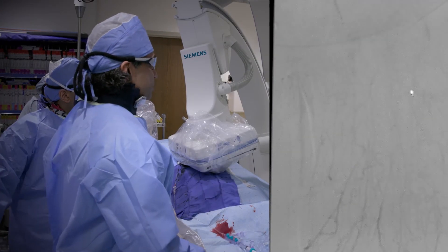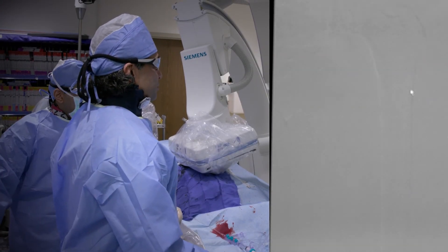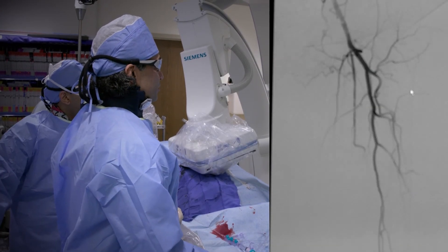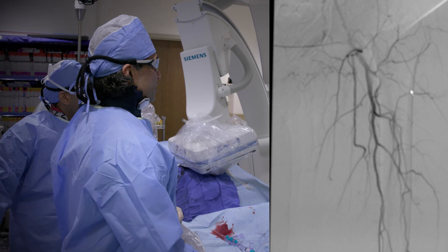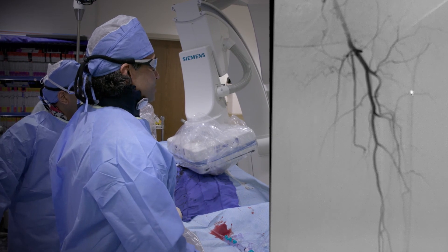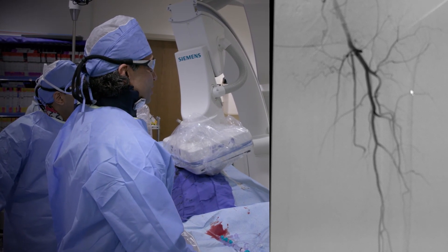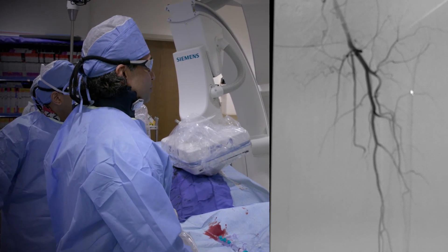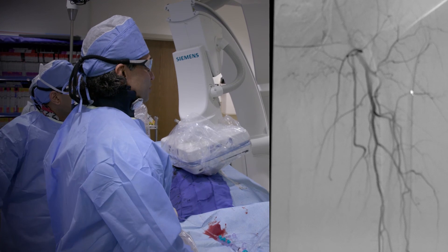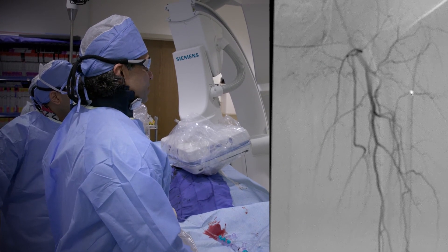The initial angiograms show the left common femoral has no significant disease. The profunda femoral artery is widely patent. The SFA comes down to approximately the proximal segment.